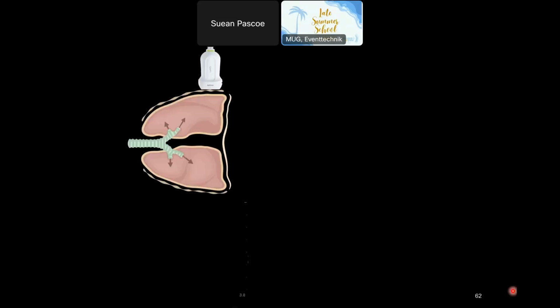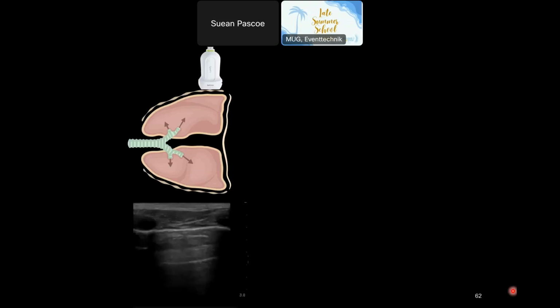if there's any pneumothorax. So we're popping our probe on the edge of the ribs here. The pleural, we look for the rib shadow, and you can see the ribs here. I look for the round rib shadow because deep to that is where my pleural line is sitting, and we have another rib here. So my eyes tune into the ribs first so that I identify the right line as the pleural line. If you have quite muscular men, sometimes the intermuscular fascial layers can be quite bright and echogenic.